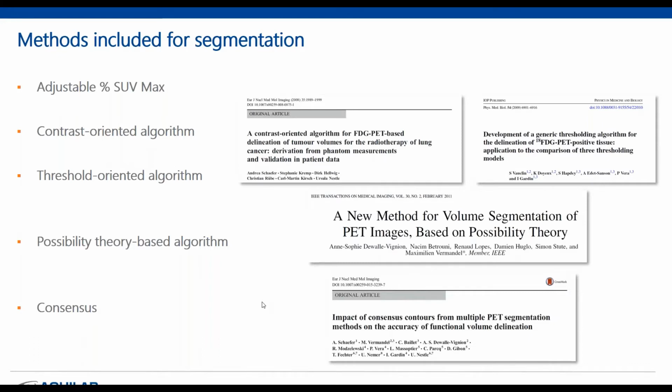To evaluate this, we used 4 clinical data sets, including different localizations like thorax, breast, abdomen. Different pathologies were also used to evaluate the accuracy and the reproducibility of the consensus. It has been done in comparison with pathology as the ground truth, or CT as a ground truth surrogate in some cases. And this study has shown that combining these different PET segmentations by the use of the consensus algorithm offers robustness against the performance of each method. So that's the global scientific part of what is included.